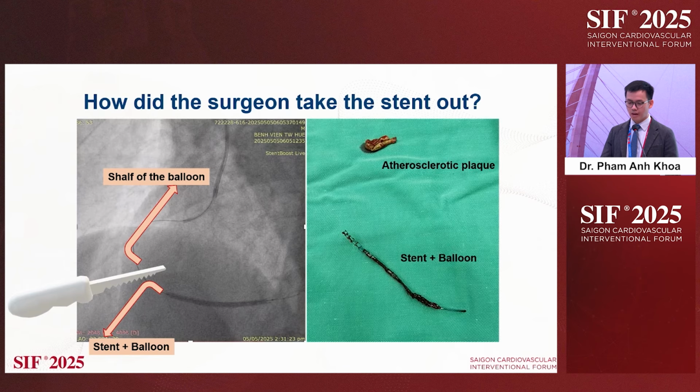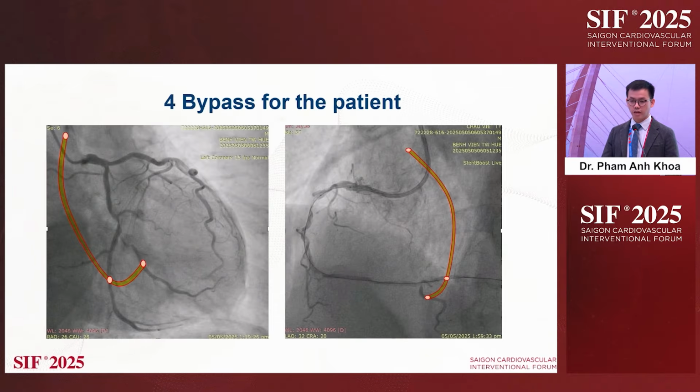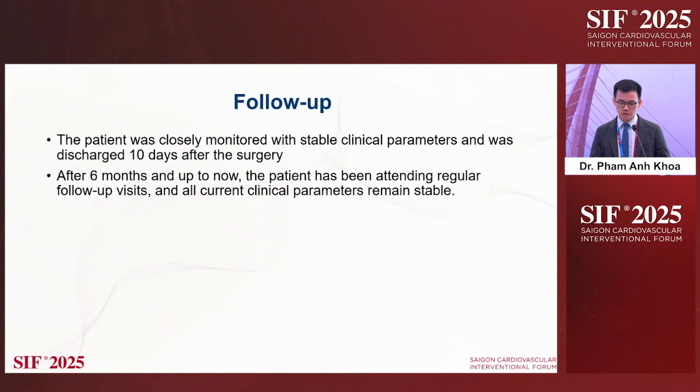And after that, they made a bypass from the LCX and RCA to the PDA and PLV. The patient was followed up around 10 days after surgery and discharged. And after 6 months, the patient is still stable until now.